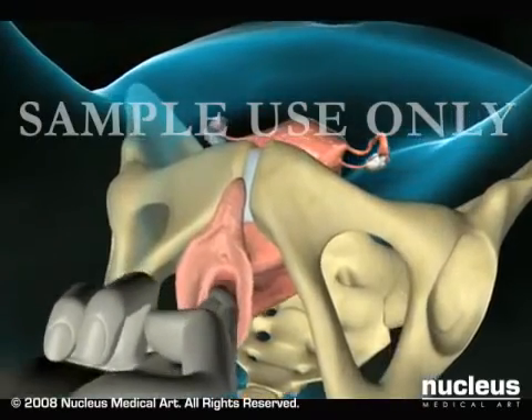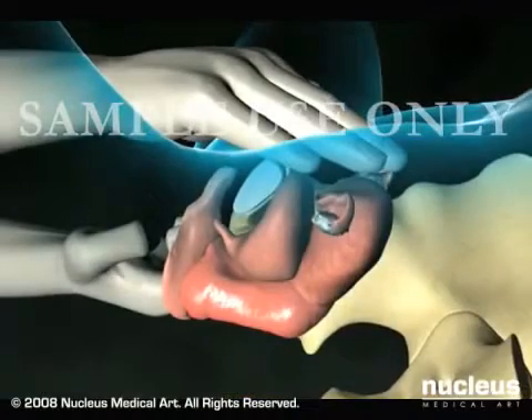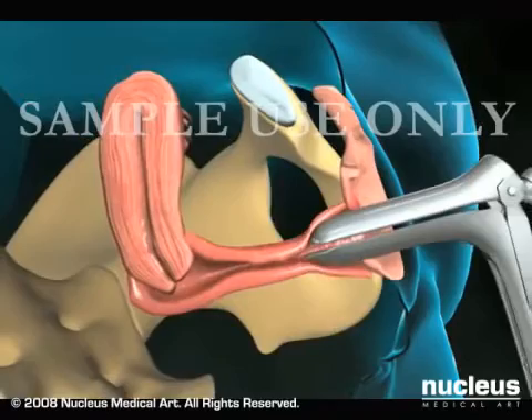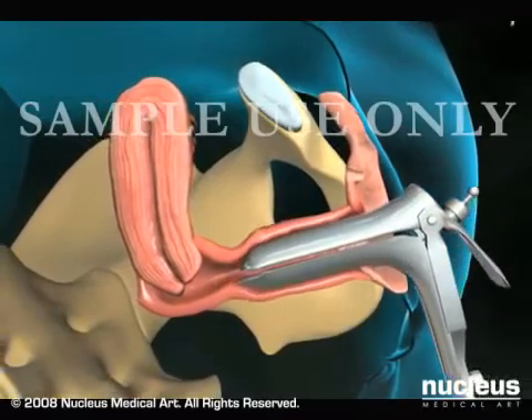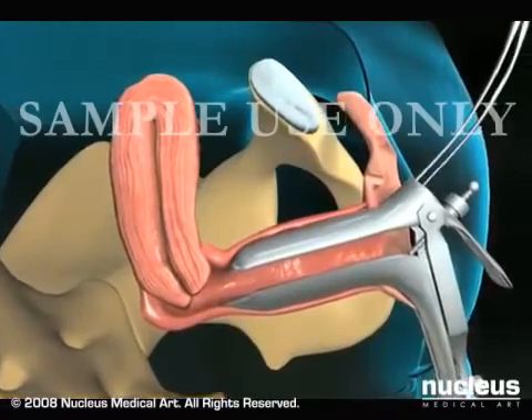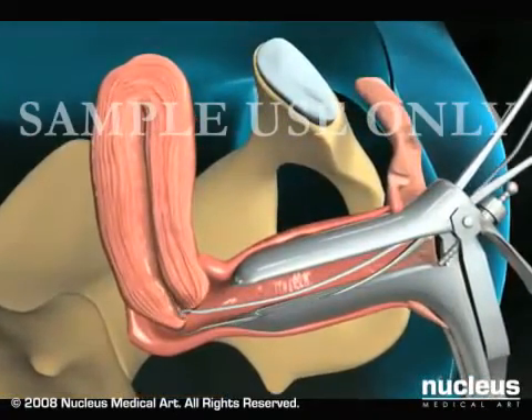Your doctor will first do a manual exam to determine the position of your uterus and then place a speculum in your vagina to open it up and keep it open so the cervix is visible. Your doctor may use another instrument called a tenaculum to grasp the cervix and hold it steady during the procedure.